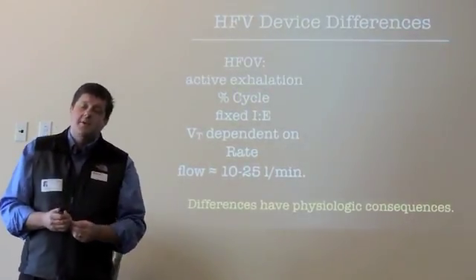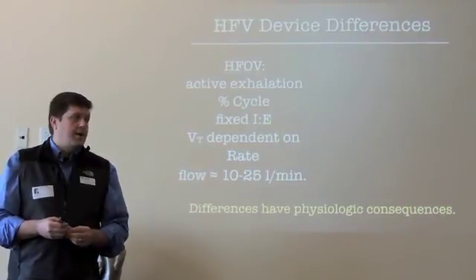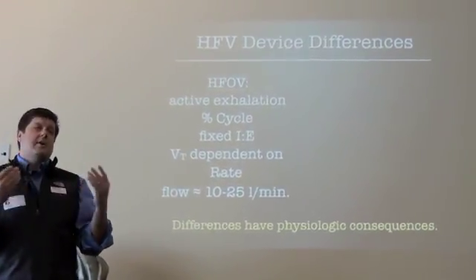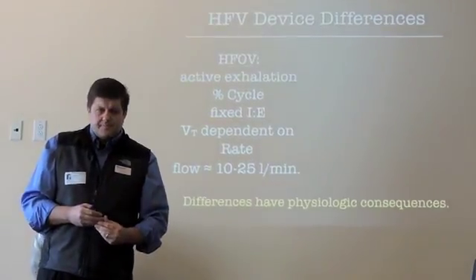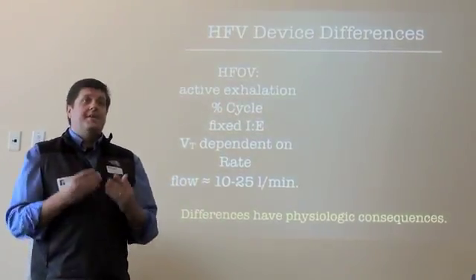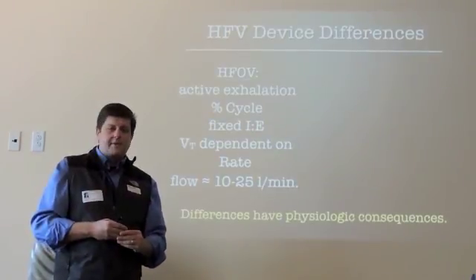Because it's a percent cycle machine, your tidal volume delivery with the oscillator is very dependent on your frequency, on the rate that you're at. So as you lower your hertz, of course, your I time gets longer. As your I time gets longer, volume delivery increases. The wonderful thing that I love about the oscillator is its simplicity. But sometimes this is where the simplicity can hamper us as far as some of our patient management decisions go.